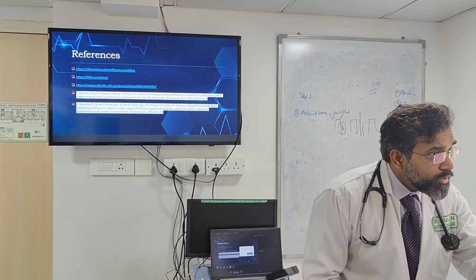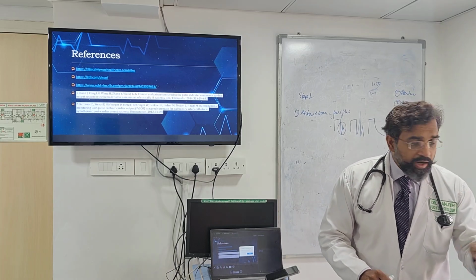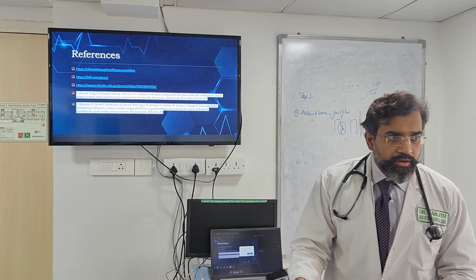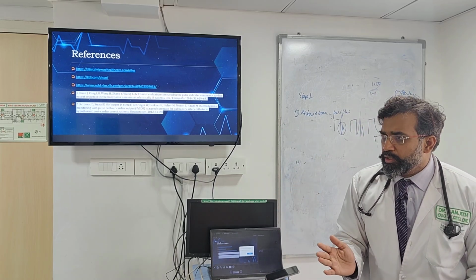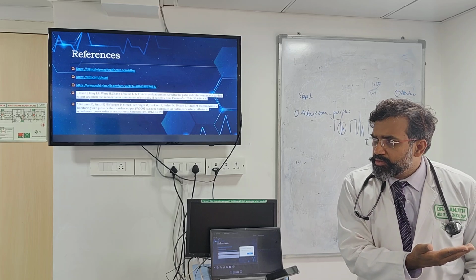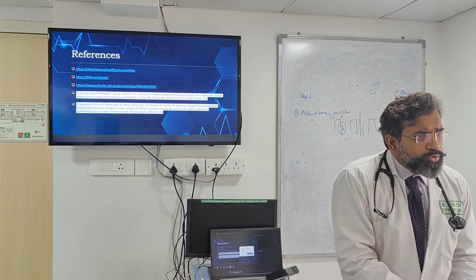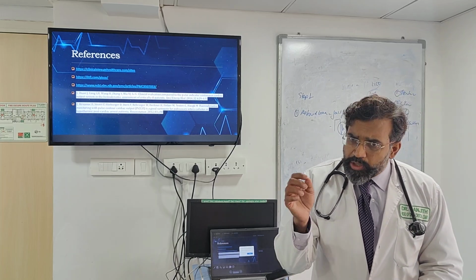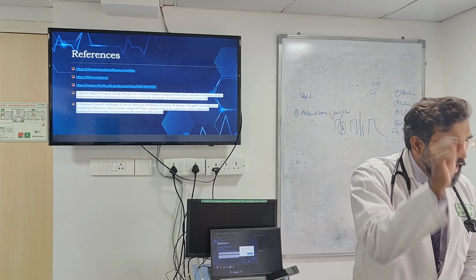So the first thing you do is what? I want to ensure that this is very important. Our nurses will not know. That's why when I say thermodilution, I want you to do it. So much of the decision making that we are doing is based on those numbers, right? And if those numbers are not right, we will be foolish to do things with this particular patient, isn't it? It will be absolute foolishness. That's why when a thermodilution is being done, stand with the nurse.